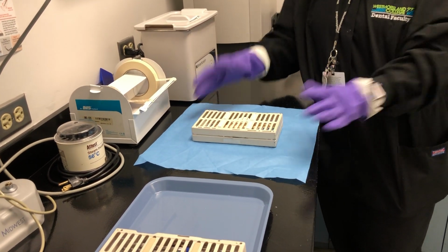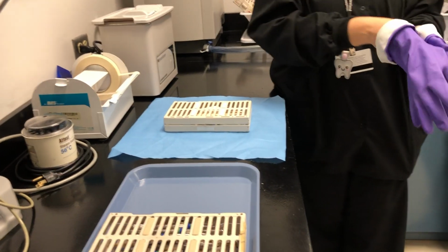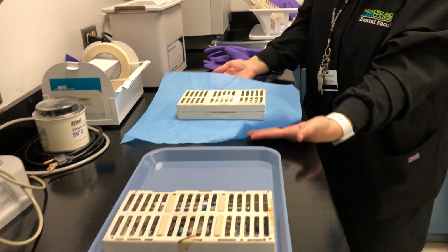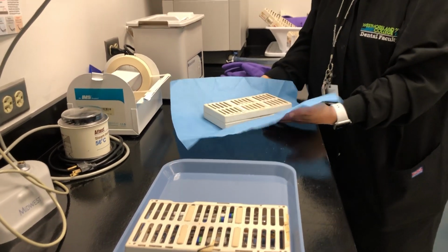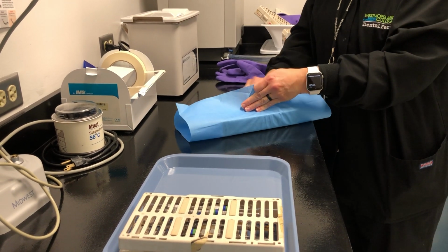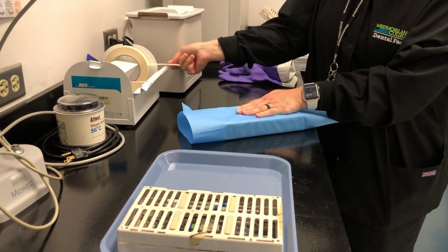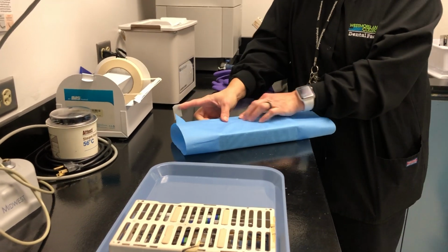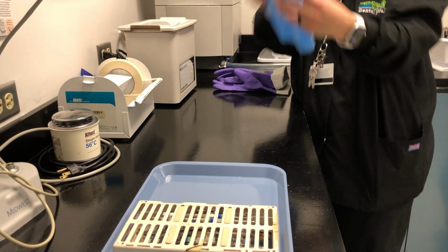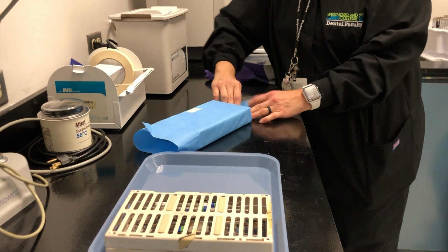So those of you that remember, it's like wrapping a Christmas present. You can actually take your purple gloves off at this point and set them aside. And we're going to wrap it, like I said, like a baby. You grab it from underneath and you wrap your Christmas present. And we're trying to be conservative with tape. So we're just going to use a small piece of tape to put one spot there, and then we're going to fold both ends.